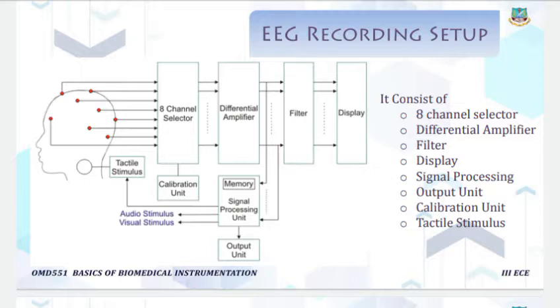So if information is passing to the brain and the brain gives back the response, right, if there is any time delay, that also will be measured here. Okay, have you understood this? And the output is recorded using a pen recorder or CRO.